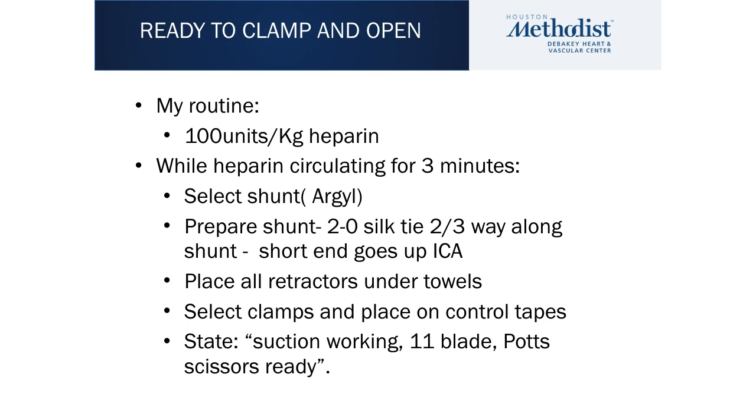During this time, I would urge you all to develop your routine. I do exactly the same thing. I select the shunt and judge the size of the shunt just by looking at the internal carotid artery. I always use an Argyle shunt. As soon as I pick this up, I take a suture of silk and wrap it around twice, placing it two-thirds of the way along the shunt. The resident ties the knot — you don't want the knot to narrow the lumen; it's just so we can pull it out at the end of the case. The short end goes up the internal carotid artery, and the long end goes down the common carotid artery.